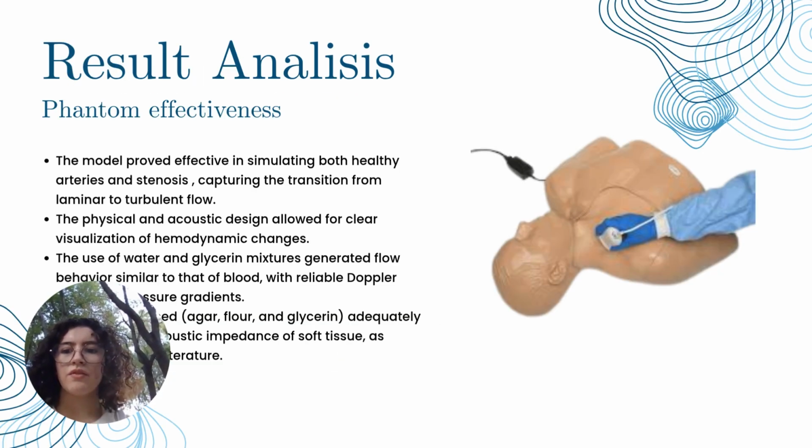Finally, we reviewed the overall results and their implications. Our acoustic evaluations and Doppler analysis demonstrated clear visualizations of the stenotic phenomenon. Laminar flow pre-stenosis, high-velocity jets within the stenosis, and turbulent recirculated flow post-stenosis are all distinctly reproduced. The phantom's structural design and material properties enable high fidelity in both qualitative and quantitative assessments, making it highly valuable for training, quality assurance, and preliminary research.